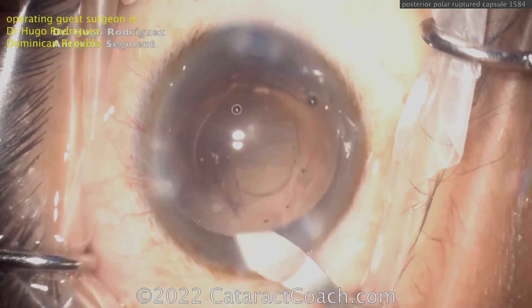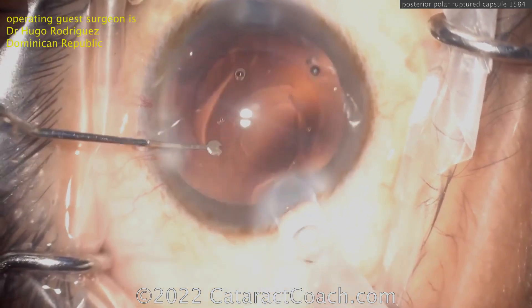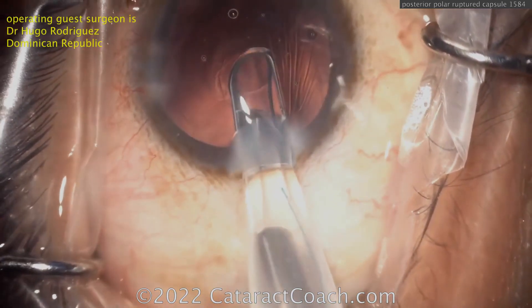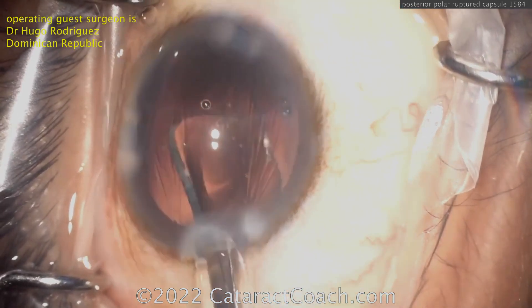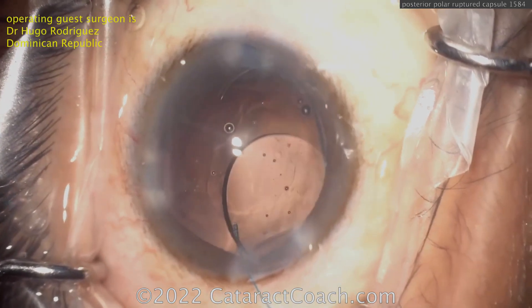Now you can slightly enlarge the incision and put a three-piece lens in — probably haptics in the sulcus with optic capture. Delivering our lens: there's the three-piece, the leading haptic going in very nicely, the optic going in as well, and then that gets dialed into position. Beautiful case here.